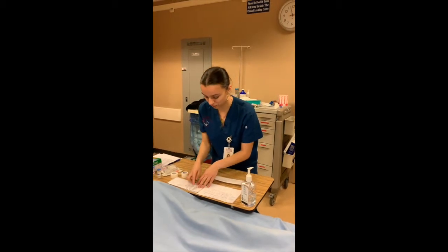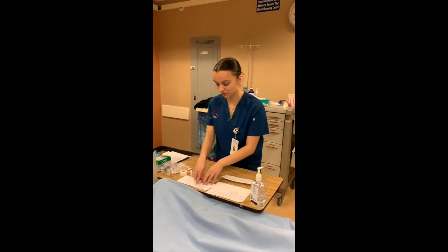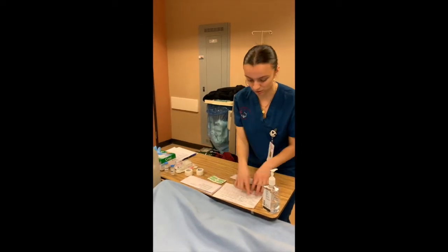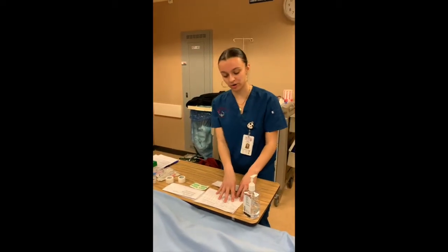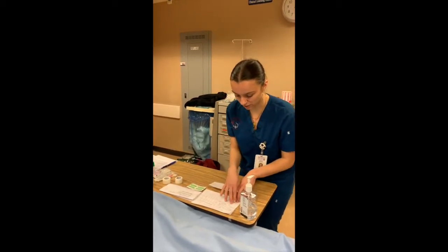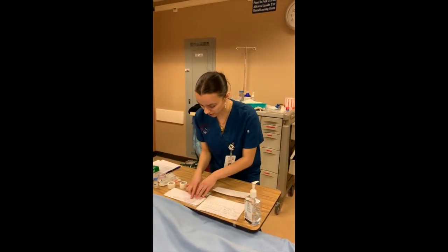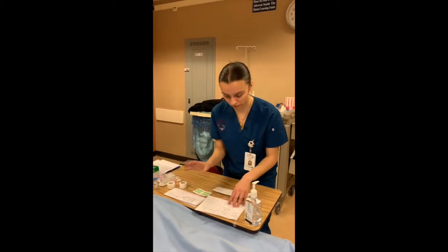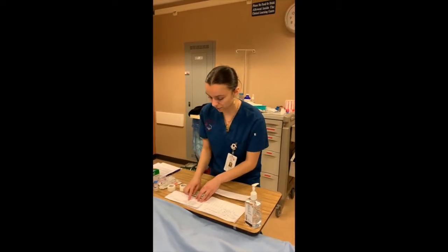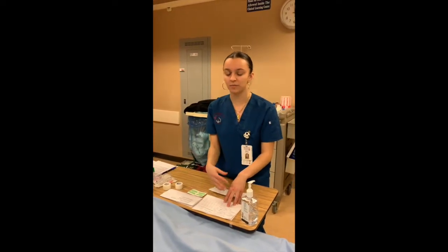So I checked with the MAR and with the charts as well. I can see that there is heparin, 5,000 units, and it's going to be given subcutaneously every 12 hours, and it is 5,000 units per 1 milliliter, as I can see right here. For the haloperidol, I calculated the dose, and after doing the calculations I got 0.5 milligrams per 1 milliliter, and that's going to be intramuscular. I checked back to here, haloperidol, intramuscular, and with the same dose, so that is good. Every 4 hours, and it's a PRN medication, and I can check over here every 4 hours PRN. The administration time is going to be at 7 o'clock today, and it's going to be given by myself.